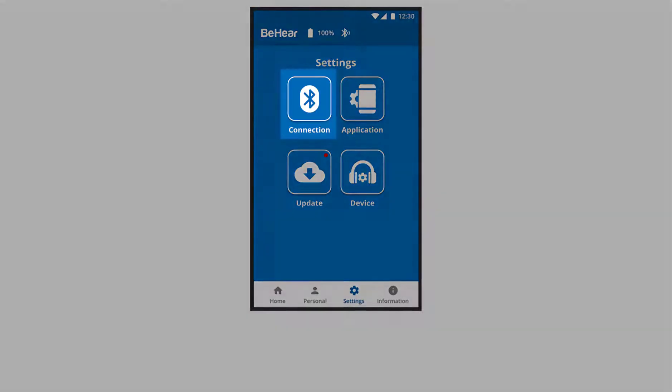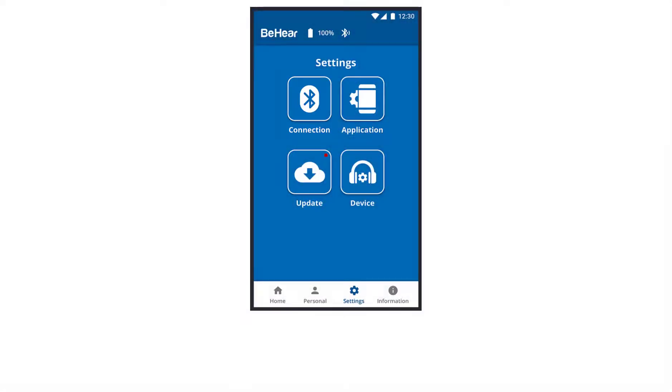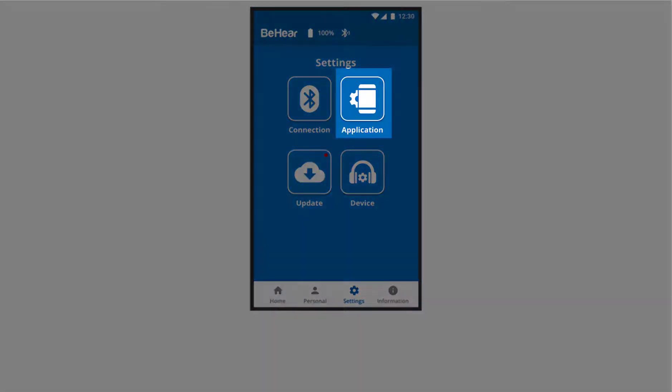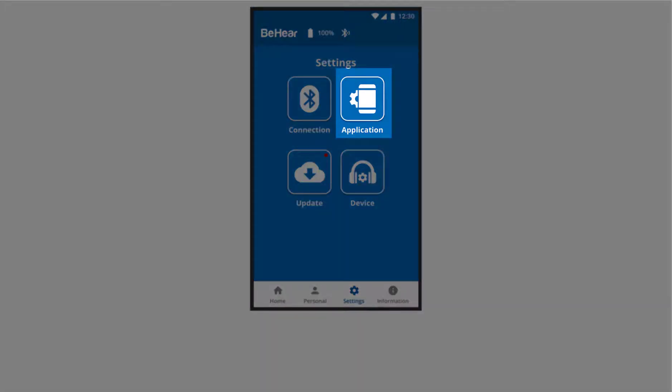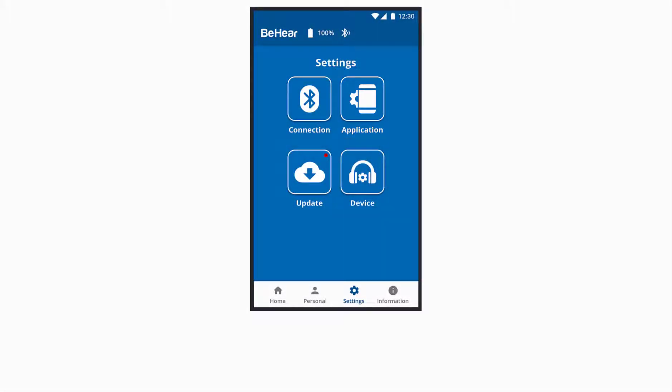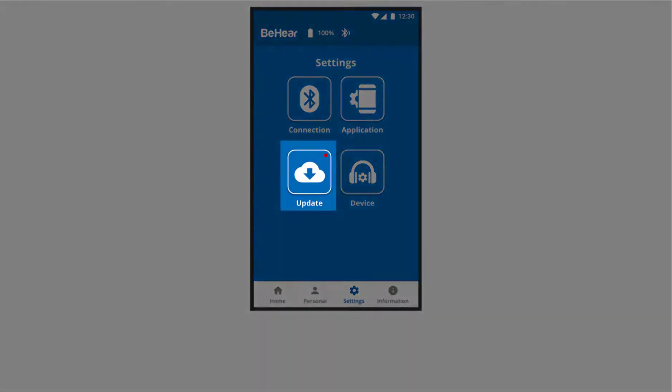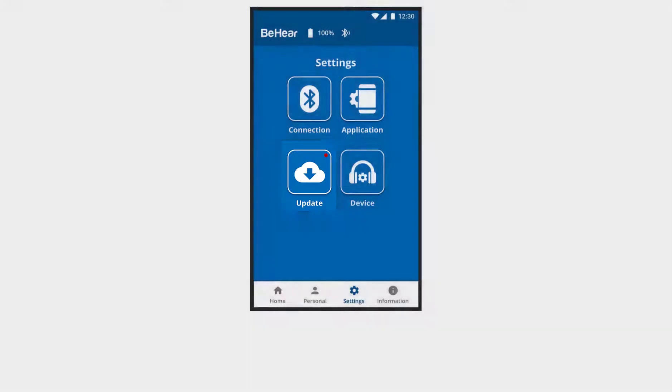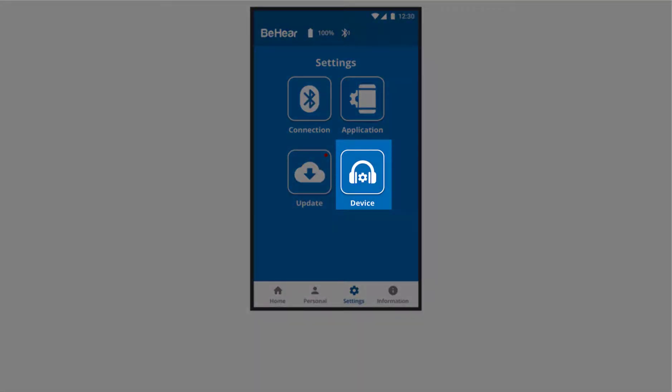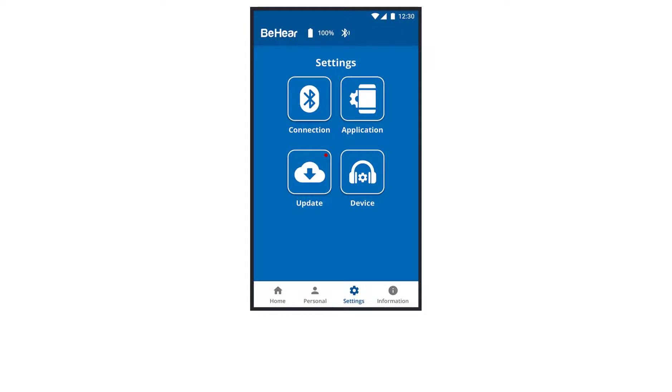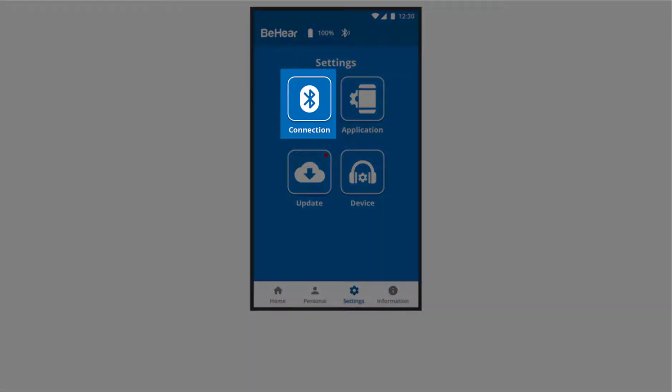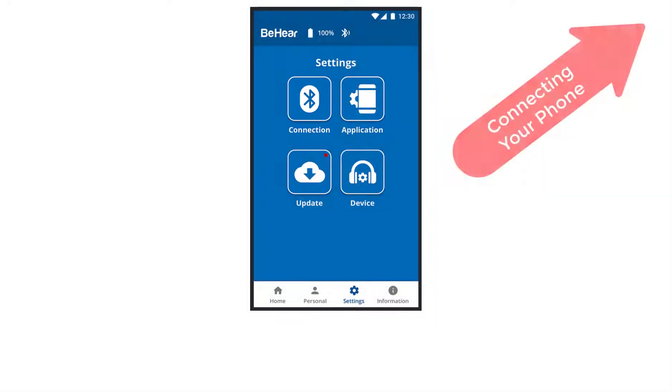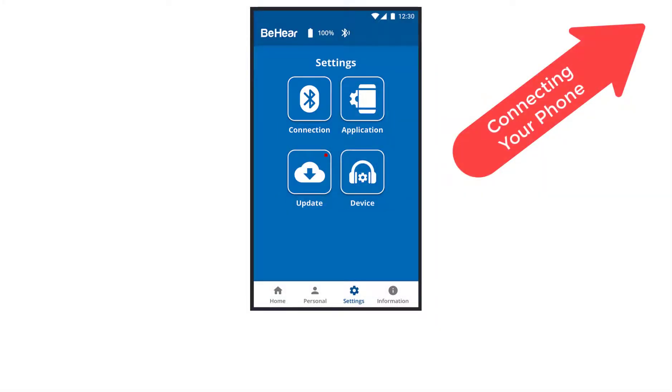Connection, for pairing your headset. Application, for determining default application behavior. Update, for searching and applying headset updates. And device, for determining default headset behavior. For more information about the connection screen, watch our Connecting Your Phone video.